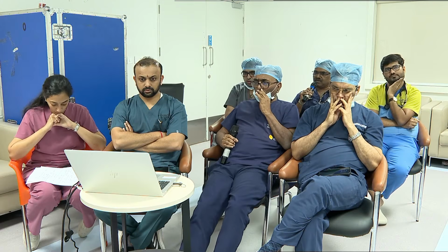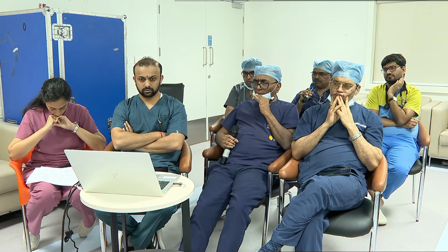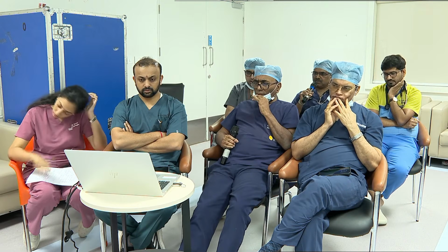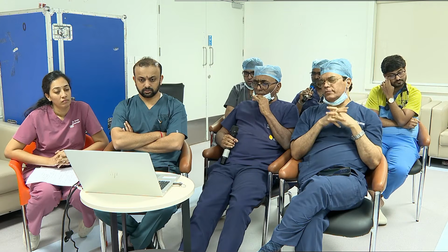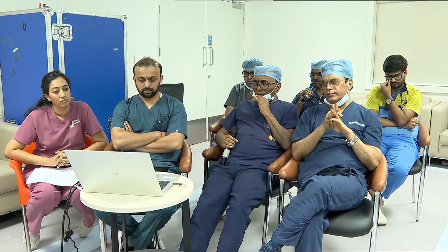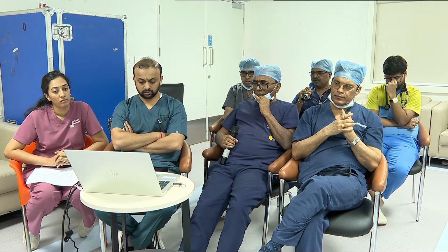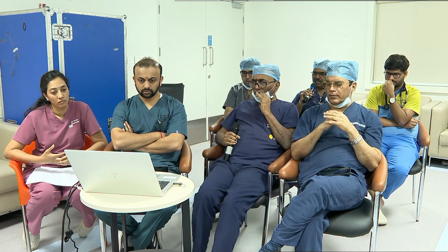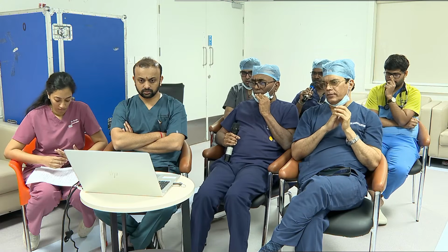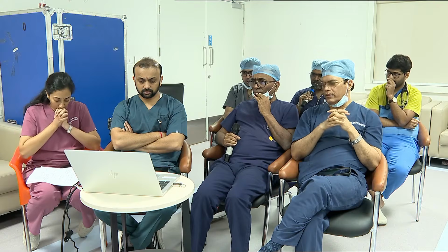The importance of image guided or ultrasound guided puncture of the femoral artery is also equally important. And when we should go for the balloon expandable valve, when we should go for the self-expandable valves, you have already told nicely. I think the required information before the starting of the procedure is adequate. I think I'll pass on this introduction.